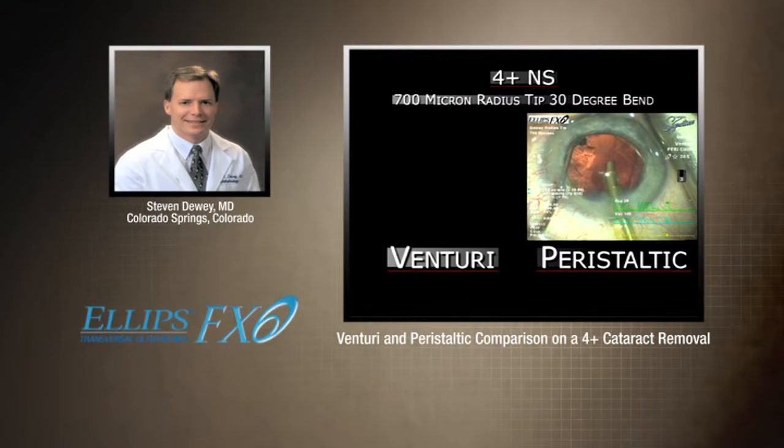For the first half it was a dead heat, but in my opinion I think Venturi is just a little more efficient, and I've actually gone to it for the majority of my procedure.